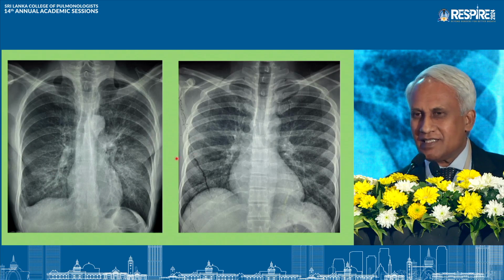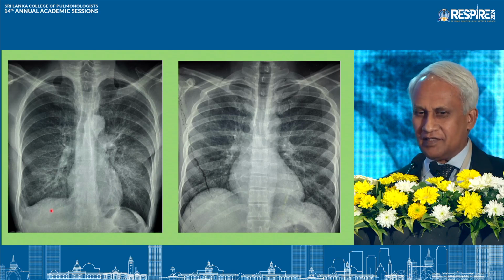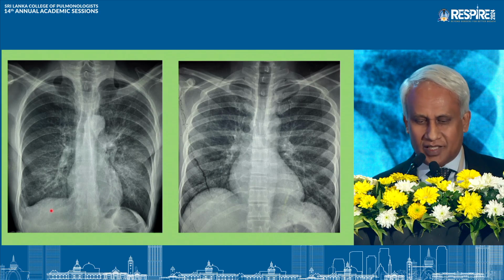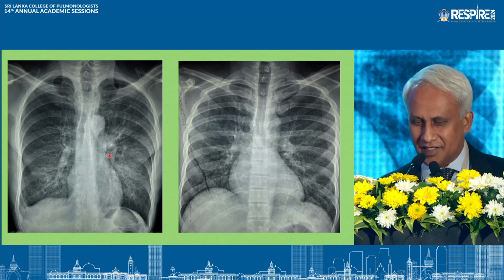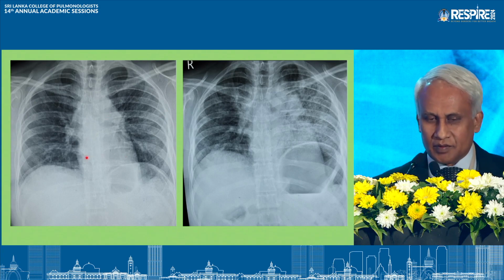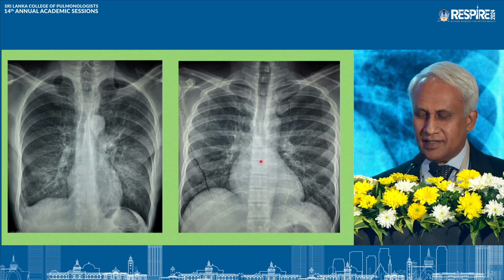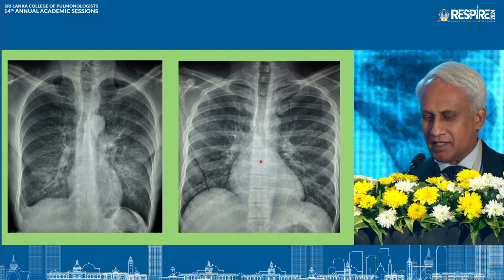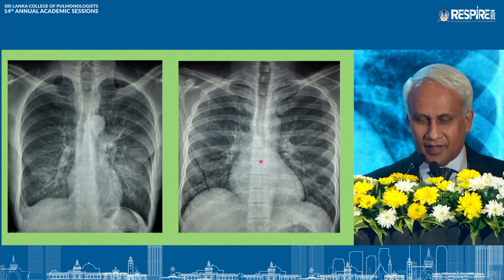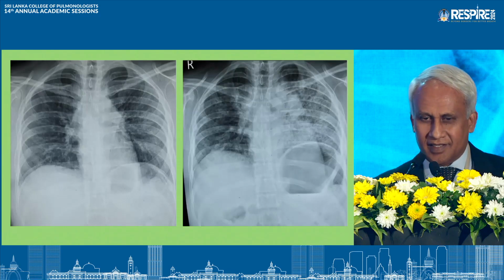And these two patients were hypoxic with very subtle X-ray changes. So always consider the possibilities of atypical infections, especially Pneumocystis carinii these days. So examine the mouth and look for extensive candidiasis in this patient. This is another patient who came. So those two patients were HIV positive. Very subtle changes. Always consider the other possibilities like acute HP and AIP, and also remember pulmonary embolism if there are very little changes.